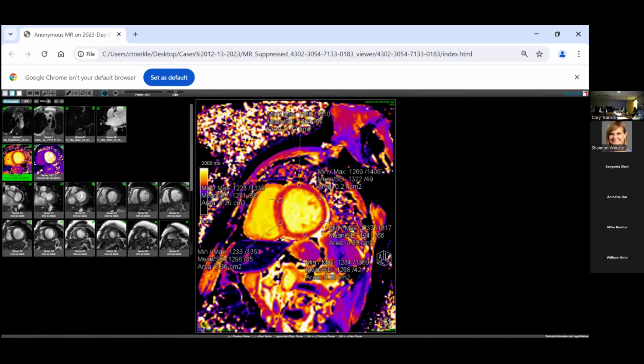They release the energy, but they take time to unwind, and we've measured that. And we said normally, and this is at 3 Tesla, this particular picture, normally that happens in 1150 to 1200 milliseconds. So what you can see here, Corey, you can point to this.